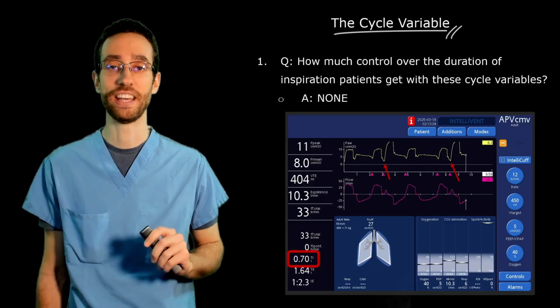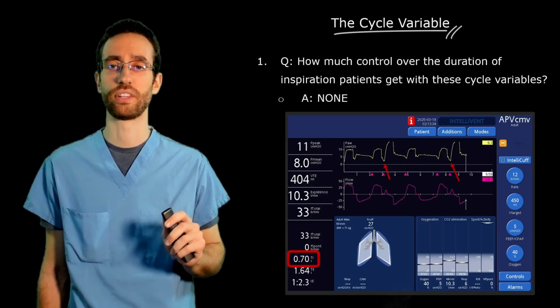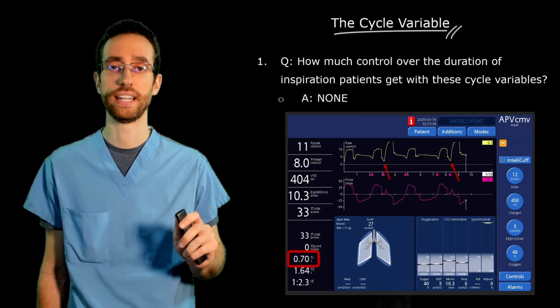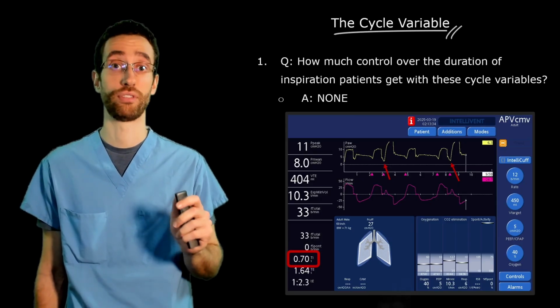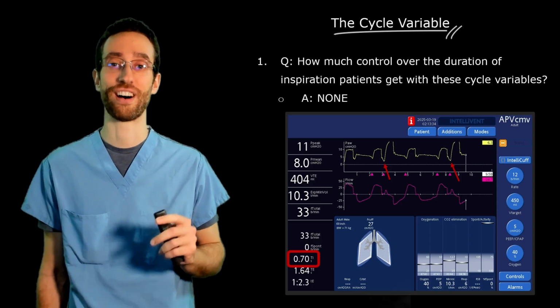We'll get there. My final question for you today is, can you think of a signal the ventilator could look for that would act as a surrogate of neural I time? Think about it, because that will be the topic of our next lecture.